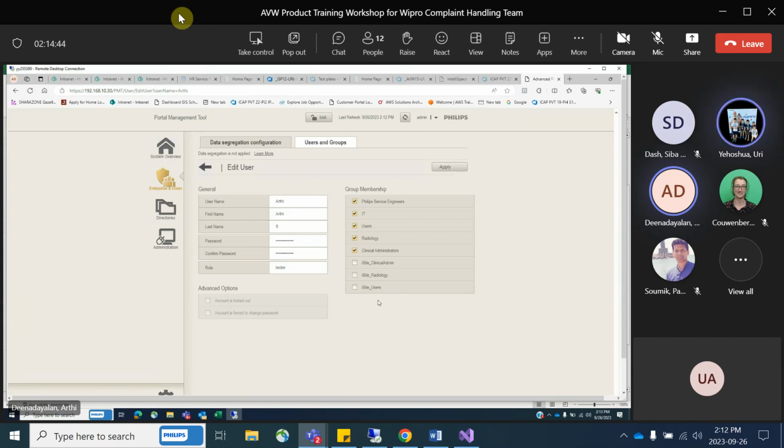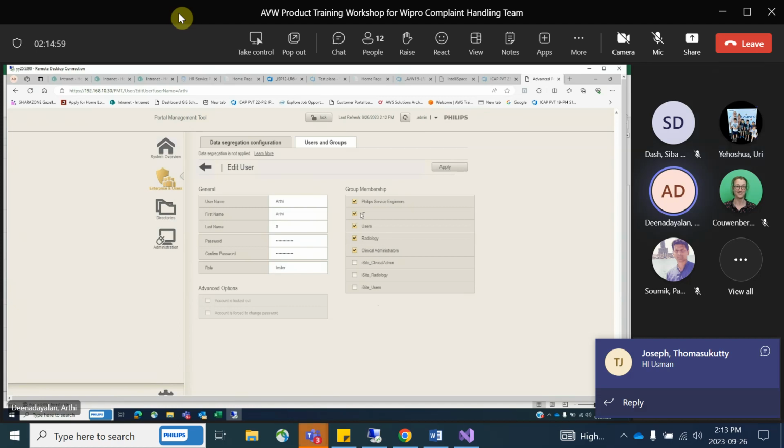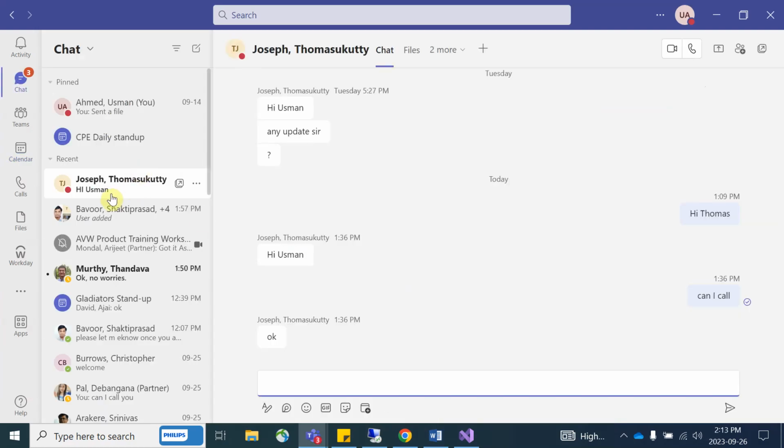Yes, I believe so, because somebody needs to control it, and we cannot give the radiologist or clinical user credential to somebody who should not have it. Since we are verifying it, we have all the rights, so we click it and we create a user. But in the hospital, I don't think so.